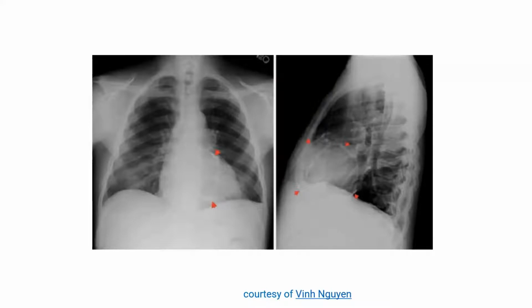Okay, is my sound okay? Yes. So cardiac CT is the best in depicting calcification, pericardial calcification, and to quantify it and to see exactly the distribution of calcium. So cardiac CT is part and parcel of pericardial or constrictive pericarditis workup.